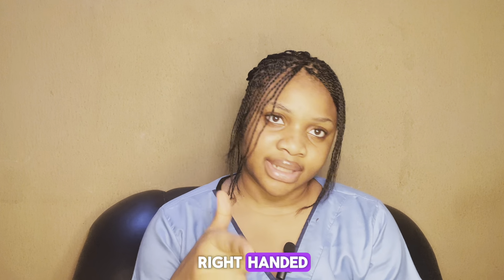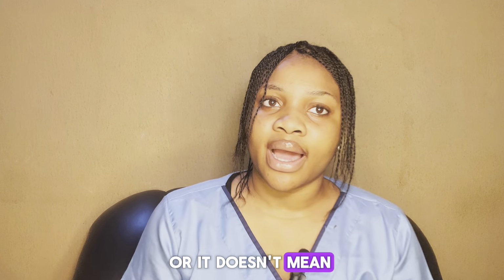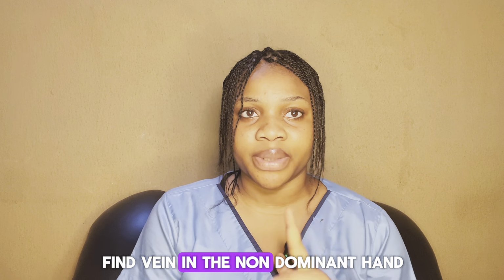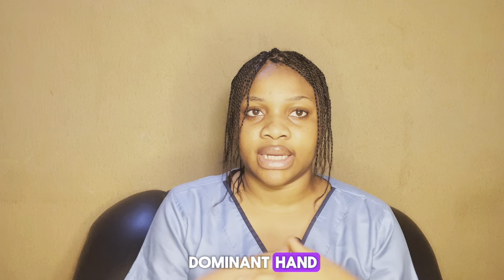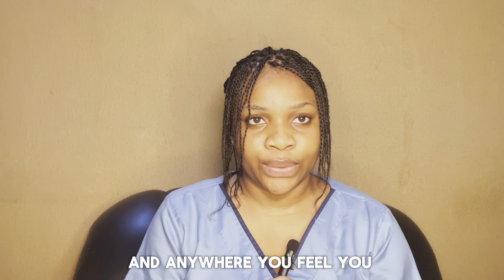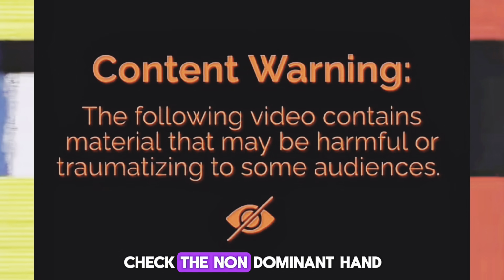But if you are right-handed, you're going to place the cannula in the left hand. But it doesn't mean that if you don't find a vein in the non-dominant hand, you keep searching and saying, no, I must use that one. Go to the dominant hand and search. And if you feel you can find a suitable vein, just search there. But first of all, check the non-dominant hand.